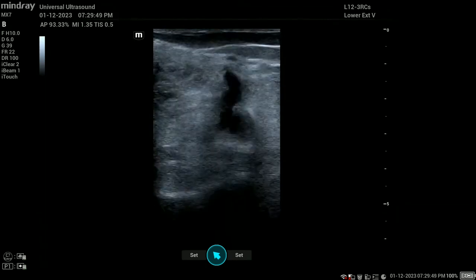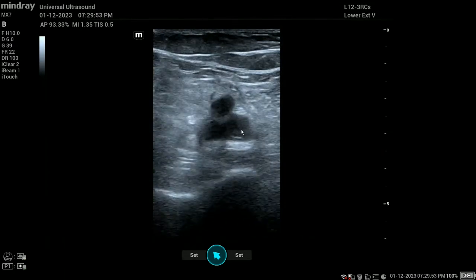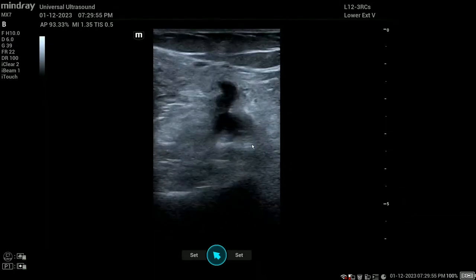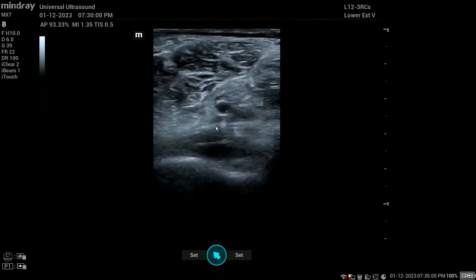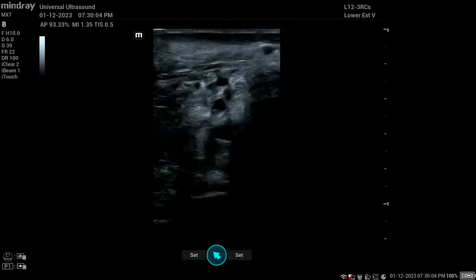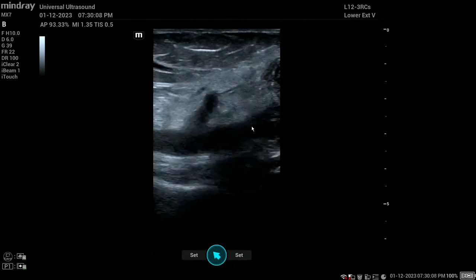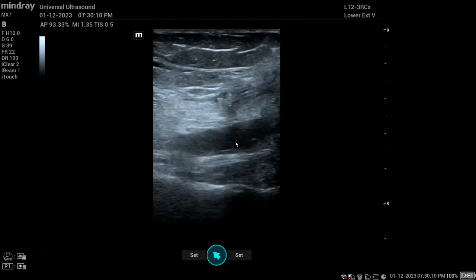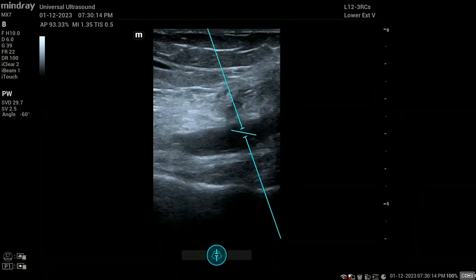So you can see as I scan up towards her head, there's the paired popliteal vein right at the mid portion, and they're both occluded. So then as I scan down, you can see they're smaller in size and partially compressible. And then we're going to head up to her outflow veins. So here we go. There's a beautiful vein here. We'll put our Doppler down.